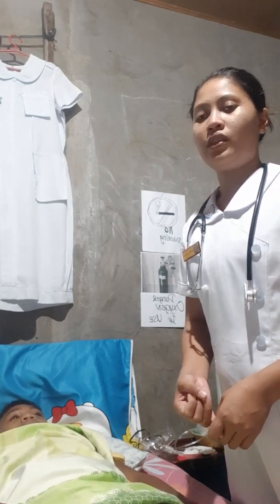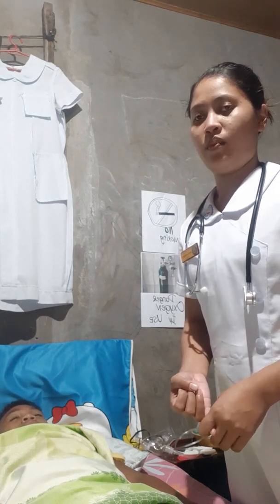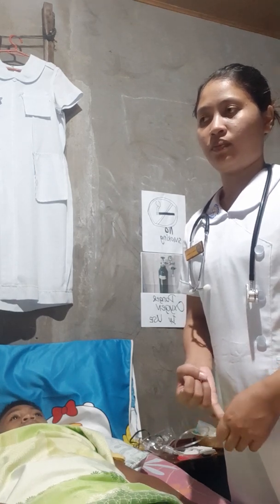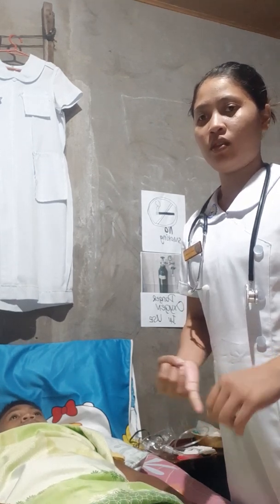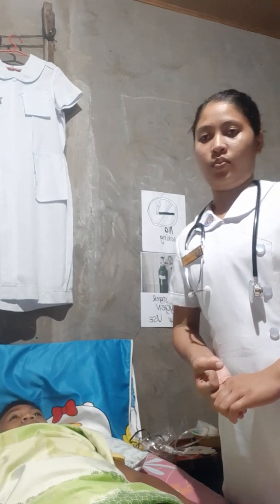Next, review the hospital record of the client, the medical record, for the order of the physician. Note the oxygen delivery method, flow rate, and the duration of the oxygen therapy.